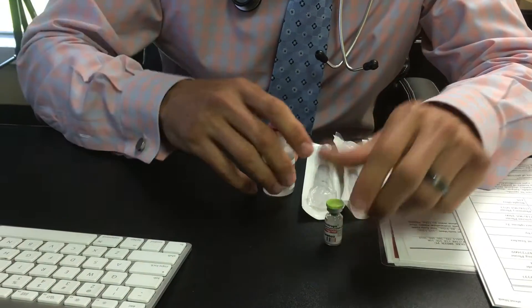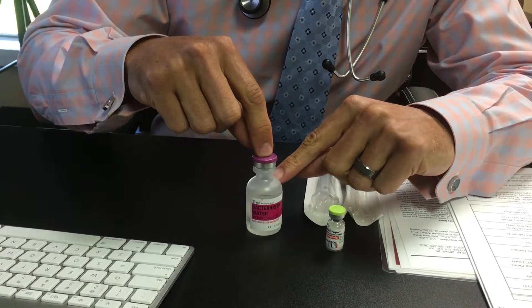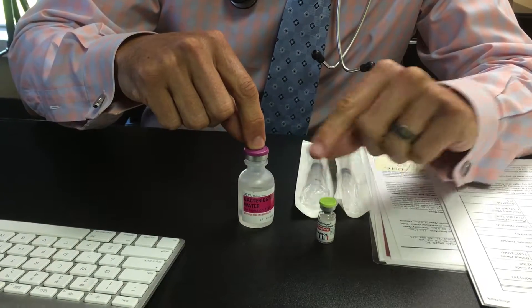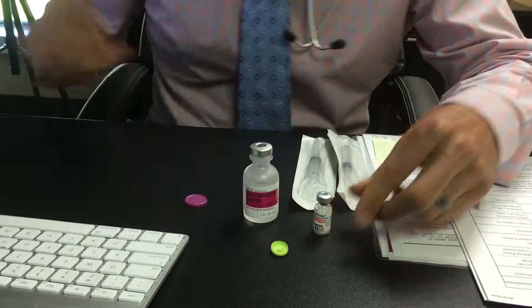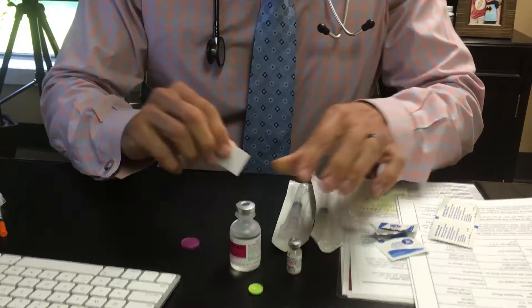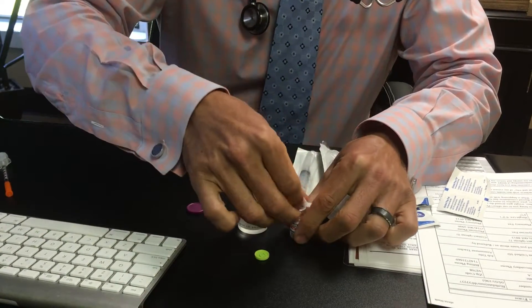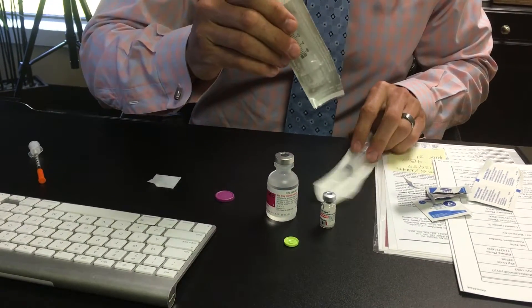What you're going to do is add 1.45, or just shy of 1.5 mls, of bacteriostatic water into the Omnitrope vial. I'm going to show you how to do this. You always alcohol off the top of the bottle before you stick a needle in it — simply just one swipe across the top.